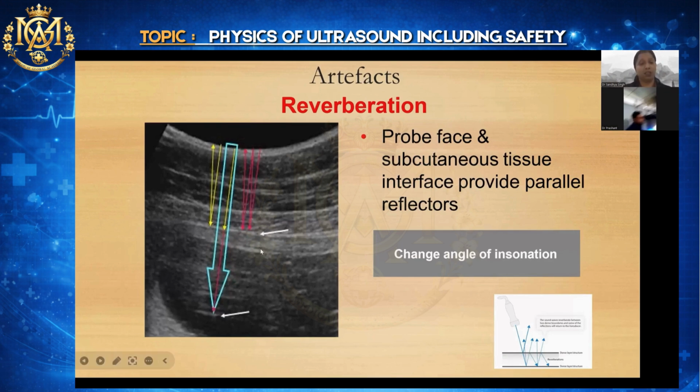See, why it is important. For example, if you start measuring amniotic fluid index, many people will just measure from here. Some may measure from here. They will think that this part they shouldn't include. So you have to take into account that you have to measure from here, not from here.